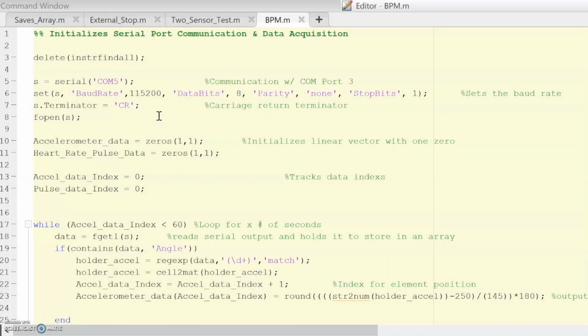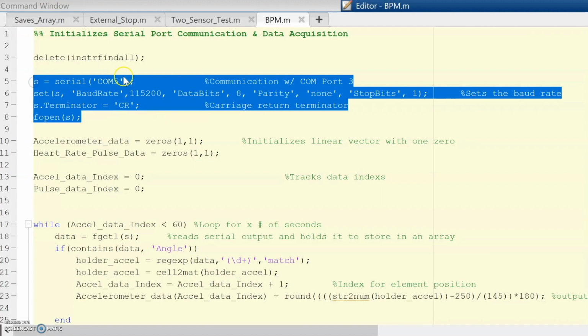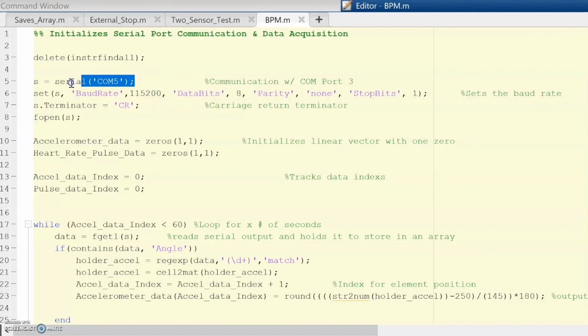So now we're looking at the MATLAB code, which is responsible for gathering serial data and organizing it into arrays based on the type of information. At the start of the program, we create and configure a serial port object and set the baud rate to the same as the Nano's code. With the serial port object open, we can now read the data that is being printed to the COM port.